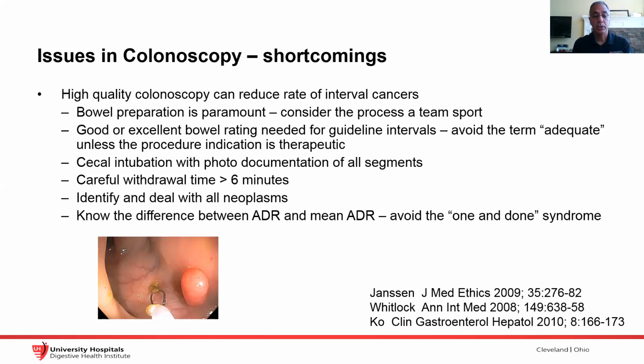Cecal intubation should occur at a very high level. We're talking over 90%. Over 95, 96%, or 98% in excellent hands. Some people use advanced techniques to get to the cecum. The photo documentation is important, although GI Quality only requires it in the cecum and the rectum. I think all segments should be photographed.